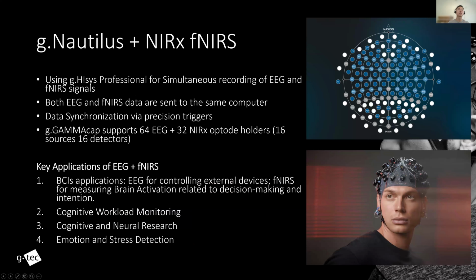Another popular combination will be EEG data plus fNIRS data. So we have a really nice combination with the NIRS device. You see the bigger optos are from the NIRS Sports 2 device. The smaller ones are the gel electrodes from g.tec. Everything can be combined into one single cap. This is the montage if you're wondering how we put the electrodes and the fNIRS optos together.